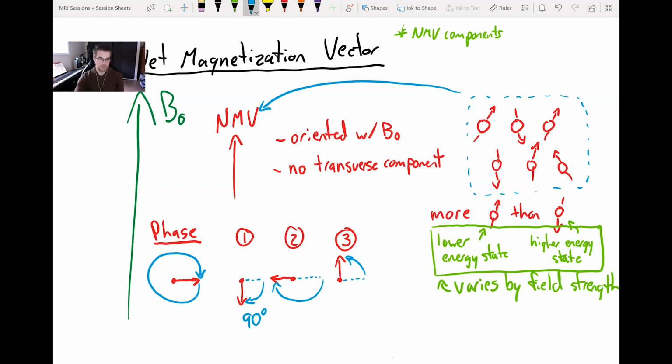Can someone in the audience tell me what phase we would denote state 2 as? That's the one in the center there. Right, Chelsea says 180 degrees. That is definitely right. Thanks for that. Yeah, so now it's completed half of that motion, and out of 360, half of that is 180. This is the most conventional way to talk about phase in MRI, so we're sticking with it.